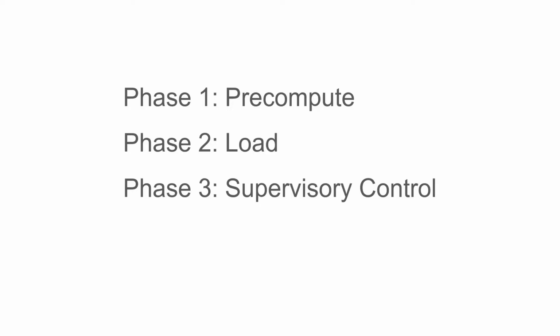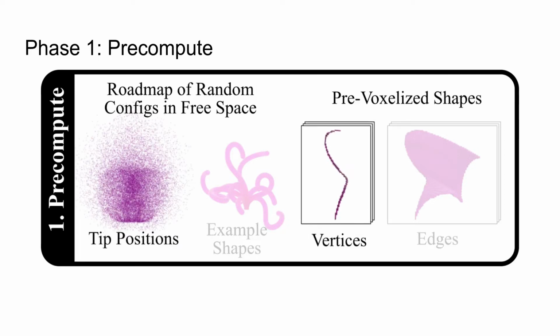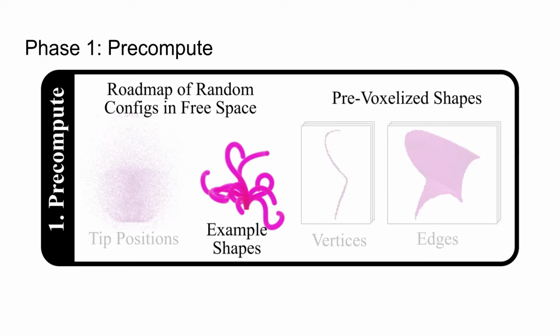Our motion planning method is divided into 3 phases: precompute, load, and supervisory control. The precompute phase randomly samples many configurations and connects them together to form a roadmap suitable for planning. For each configuration, this roadmap stores tip positions and the robot's voxelized backbone shape. Here are 10 example robot shapes from the set of 30,000 tip positions on the left.